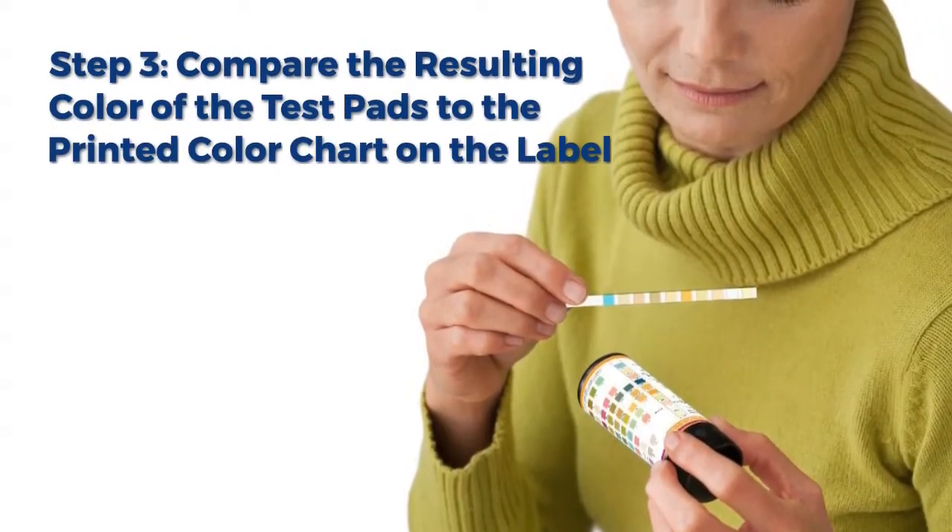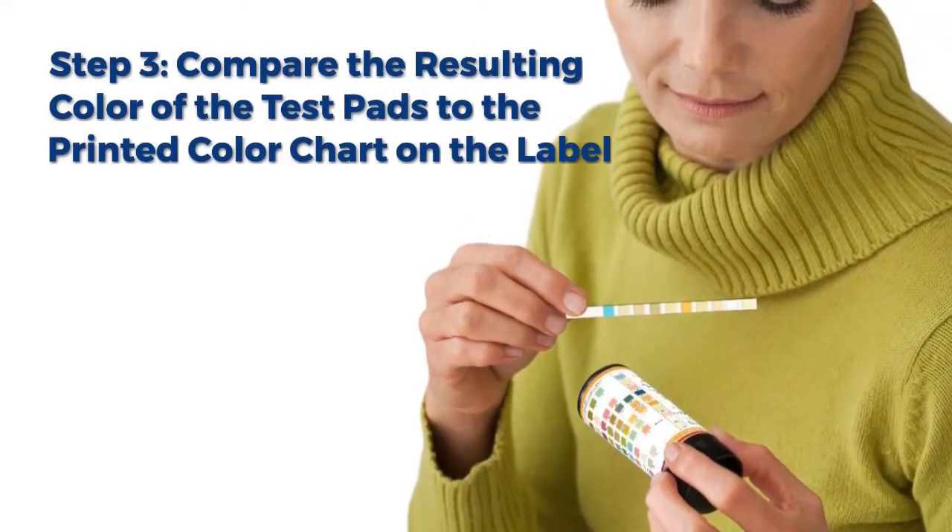Step 3: Compare the resulting color of the test pads to the printed color chart on the label.